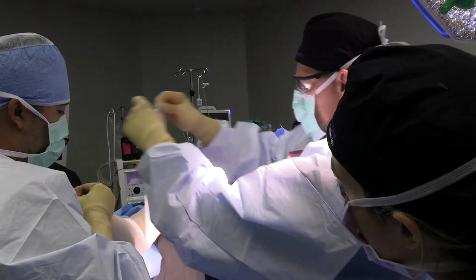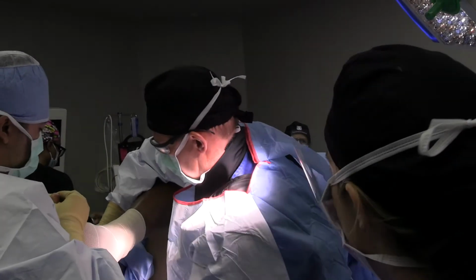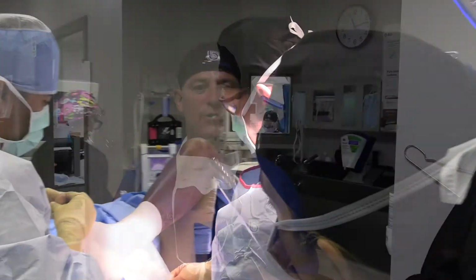So that case went really well. This patient broke the small bone in his foot, the fifth metatarsal base. We call it a Jones fracture. People usually get it by just rolling their ankle. This guy broke his bone there, and we typically will go in and fix those with a screw. The reason is, if left untreated or left to heal without surgery, they tend to go on to nonunion quite commonly. And you can see this case only took a minute or two to do.